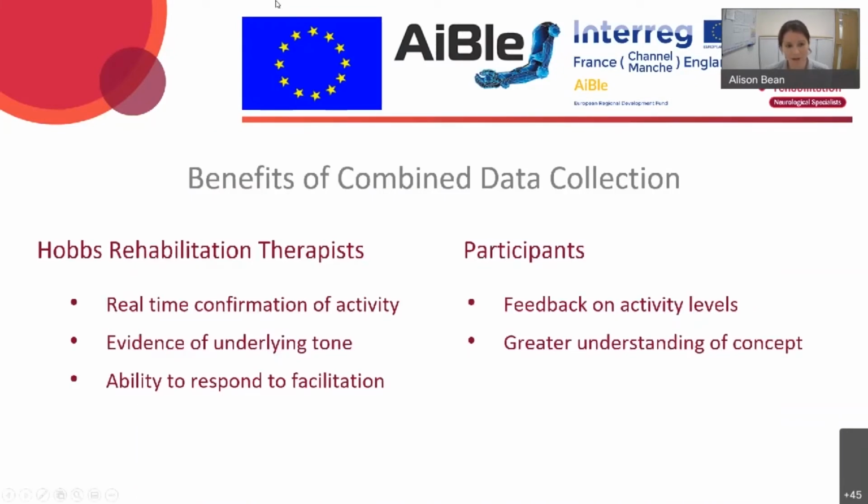Okay, so hopefully from that you can understand how having the combination of the visual EMG, the video, and the therapist prompting, all of that combined, can really help the picture for the Portsmouth Uni team when they come to analyse that data. But what I'd also like to reflect on is how this combined approach also benefited Hobbs therapists and patients. So for the therapist, when we look at these EMG traces, we don't necessarily understand exactly what every trace means, but we do get some real-time confirmation of whether or not a patient is generating activity.